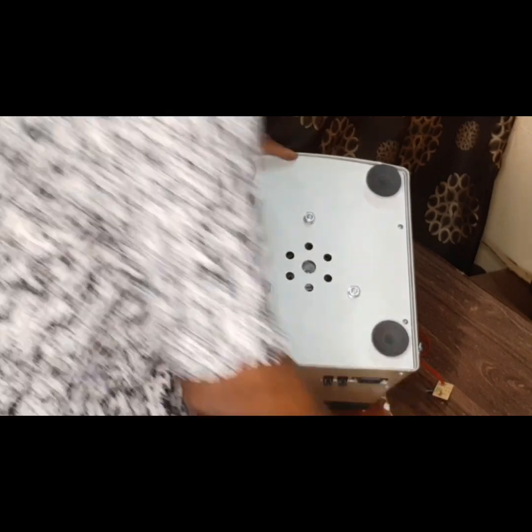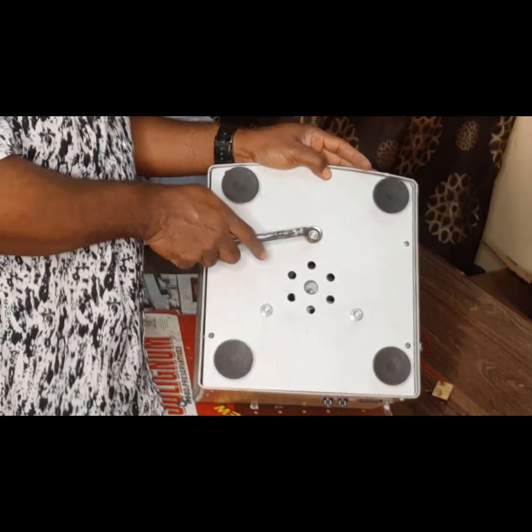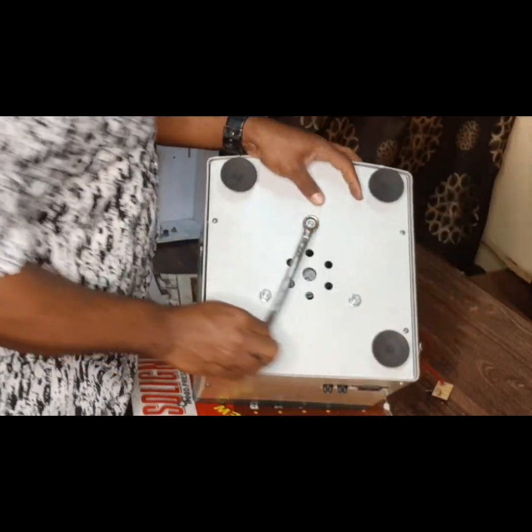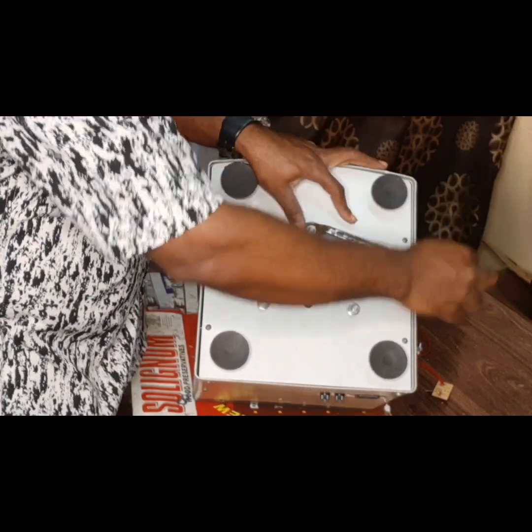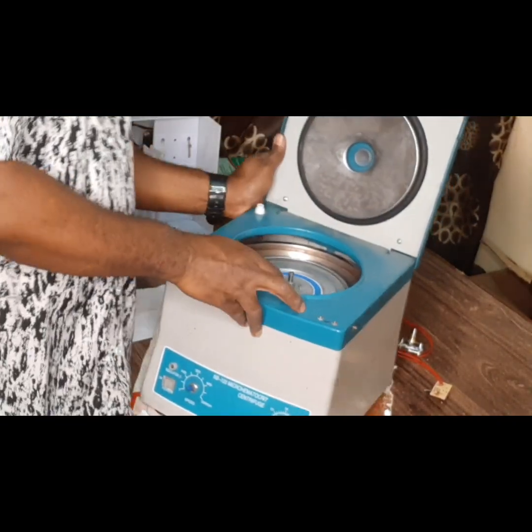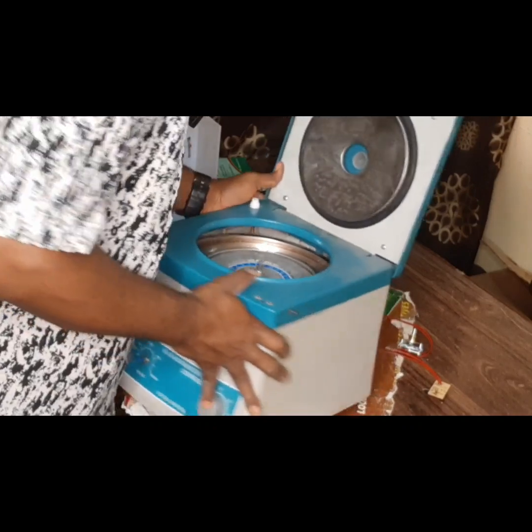You can see I've been able to secure the nut. And this is for the motor. It's necessary to evenly secure the electric motor base. So having done that, we're going to spin it to see if it is free. You see, it's free.